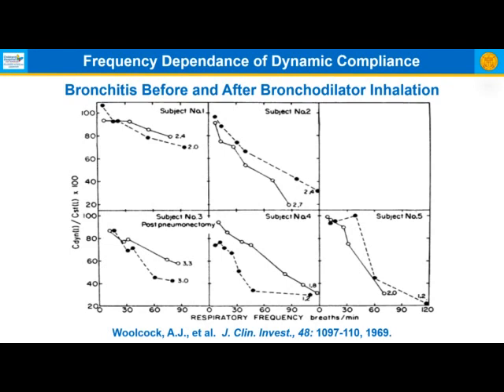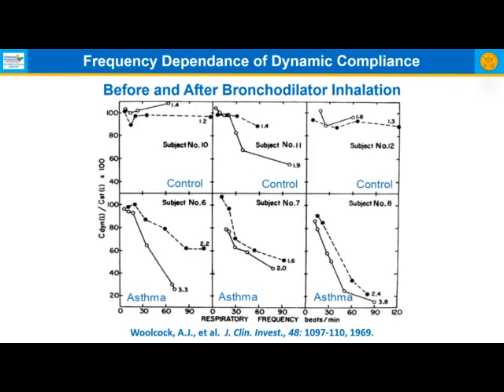And note that there's not much change. And the reason is that frequency dependence of dynamic compliance is measuring primarily small airway function. But asthma, or the action of bronchodilators, is in the large airways. Here we have, again, before and after, we have some controls. With the exception of this guy, no difference. And these asthmatics, again, there's no difference pre and post.